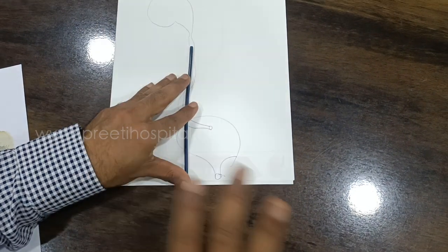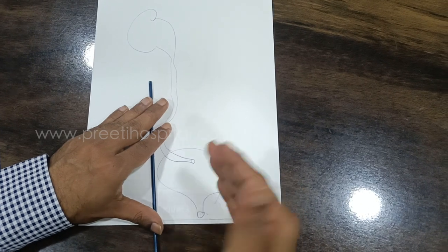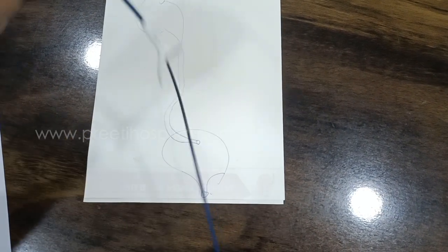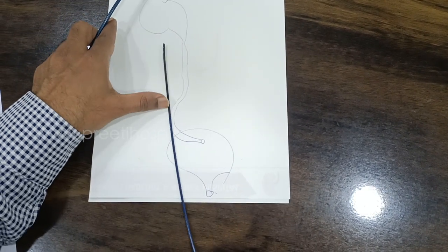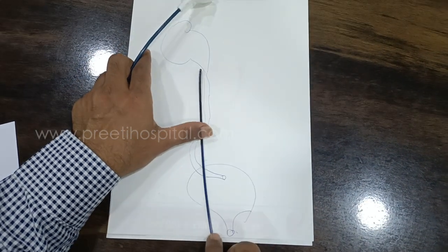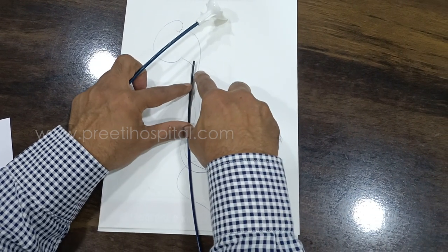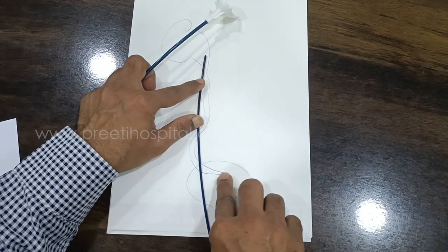People are doing without access sheet also. Without access sheet, they are doing easily. Not a problem over the guide wire. There are advantages, disadvantages. But ultimately, when the access sheet is not there, again water has to come through this narrowing, this narrowing, this narrowing into the bladder. Otherwise, kidney pressure will raise.